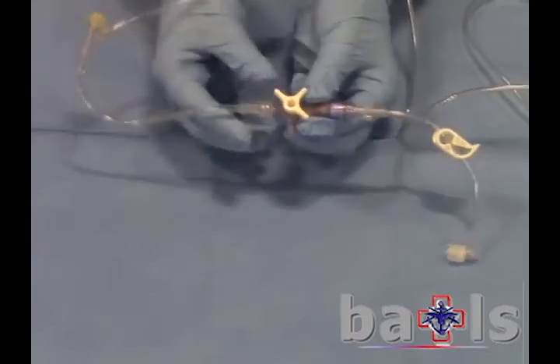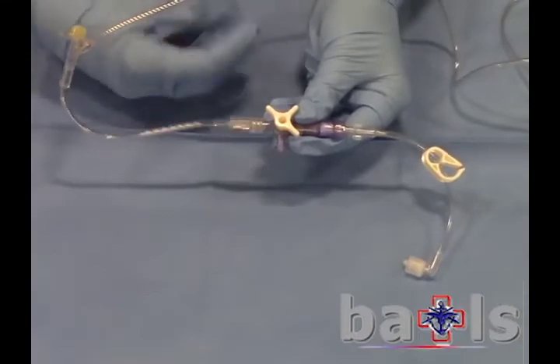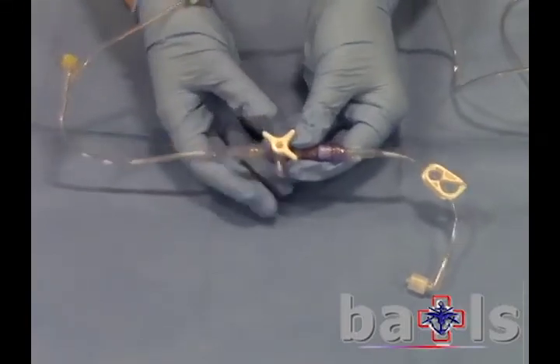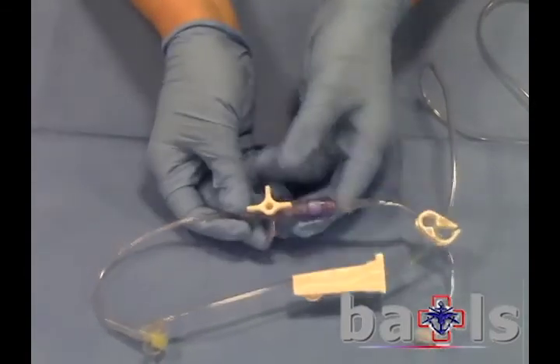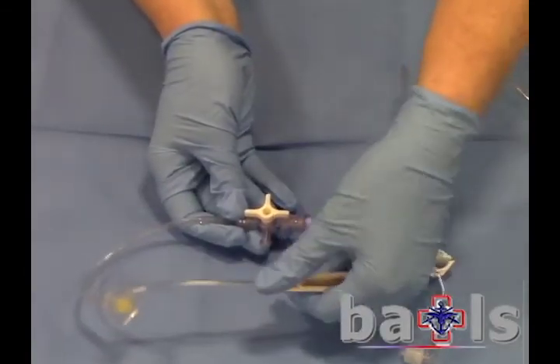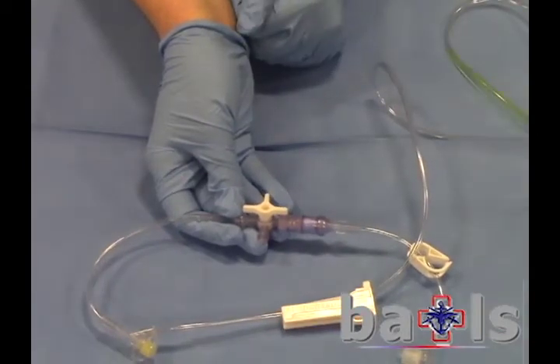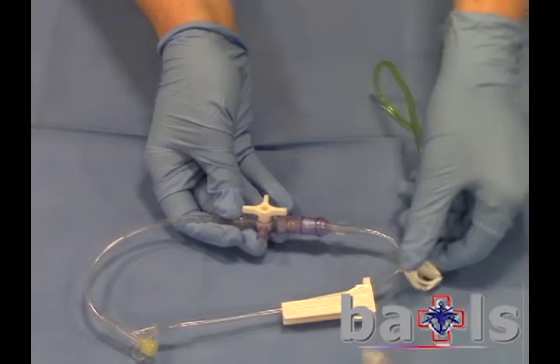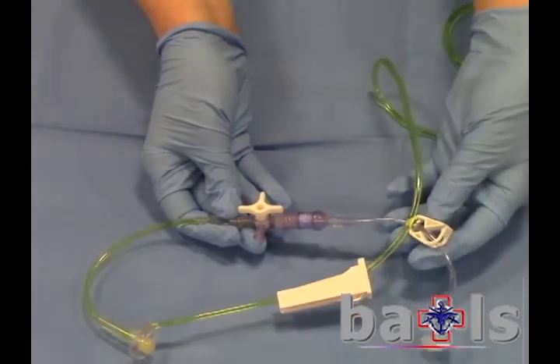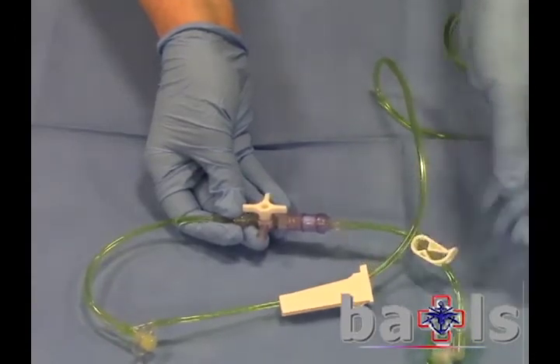To prep the system, open the clip on the extension and set the 3-way tap so that only the ports to the bag and to the extension are open. Unlock the giving set and allow the fluids to flow through the assembly. Then lock off the clip on the extension and close the giving set.